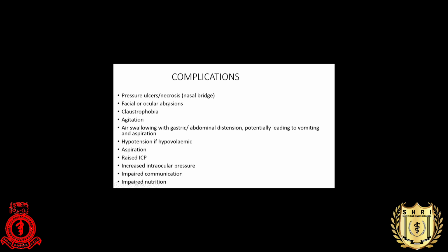There is also claustrophobia and agitation, and it can cause hypotension in a patient who is already hypovolemic. There is increased risk of aspiration, and it will increase the risk of intracranial pressure and intraocular pressure. And if you put the patient on a mask, it is difficult to give food to this patient.